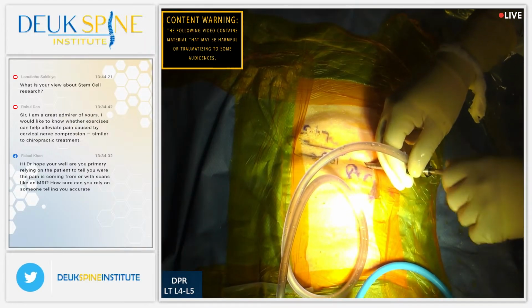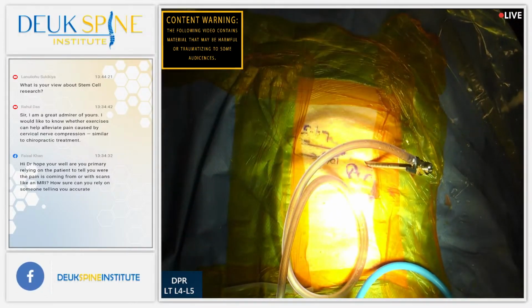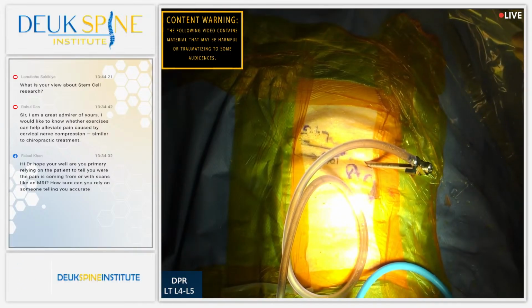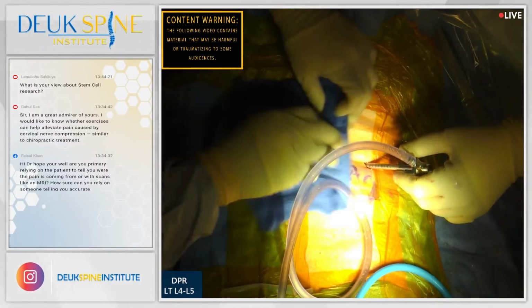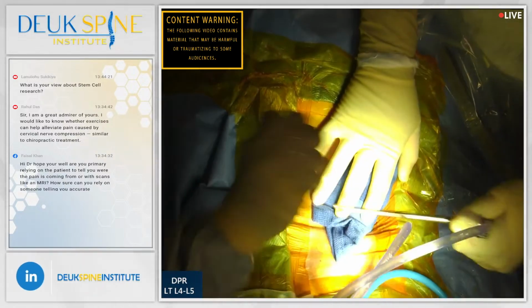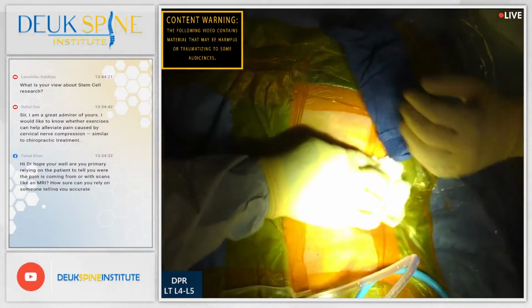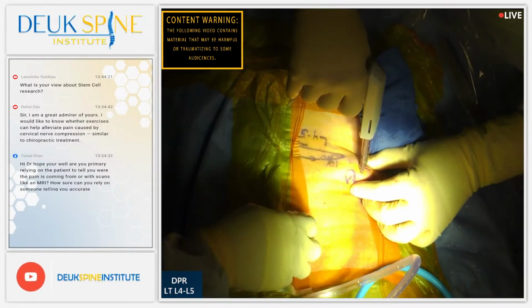He's actually leaving right now the surgery center, and he's so happy with his results. So exercise, which helps muscles, will not cure neck pain that comes from a disc problem or a facet problem. You must have the disc treated and the facet treated, okay? All right, we're going to keep going. I'm going to staple this closed, and then we're going to fix the facet joints on this left side.